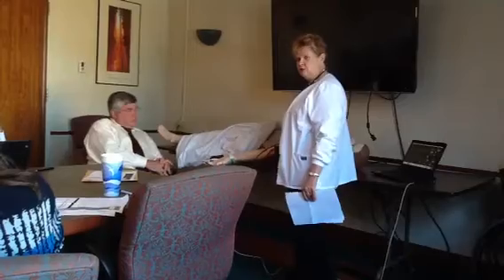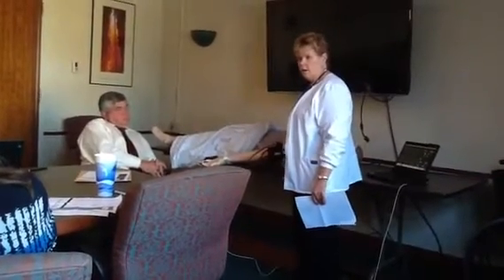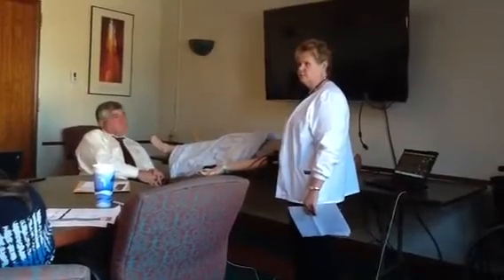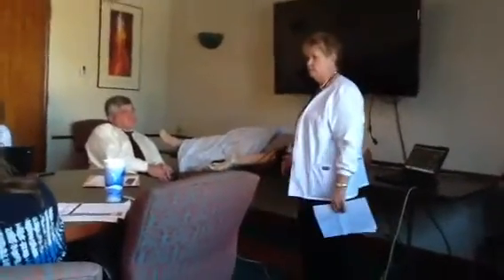His heart tones can be changed. He can have a murmur. He can have a rub. What else is listed there, Kevin? All kinds of things. You can simulate whatever you want, really. We can have different heart tones.